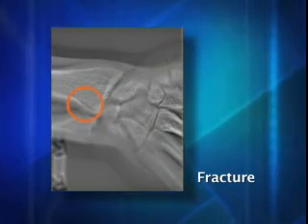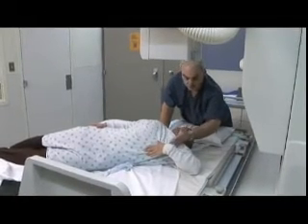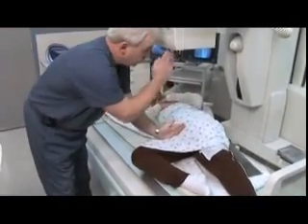The post-processing demonstrated some clinical findings that we were just astounded with once we started to think a little bit against the technical thinking of a radiographer. We have certain protocols in X-ray that we do. The shoulder, we turn it a certain way. The femur, we turn it a certain way. The hip, we do certain things with. And what we found was that if we modified those positions somewhat, we were able to get much better enhancement and much better detail.